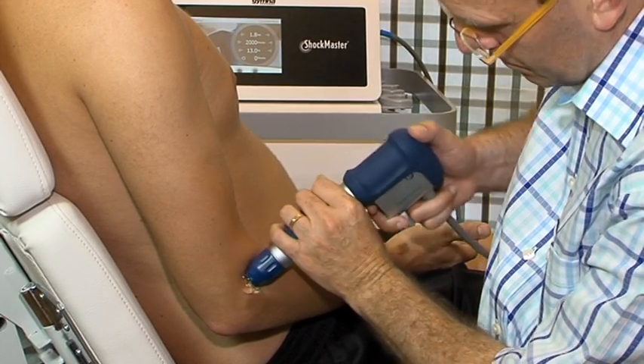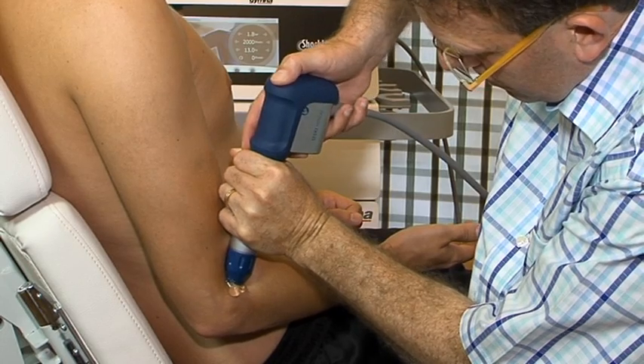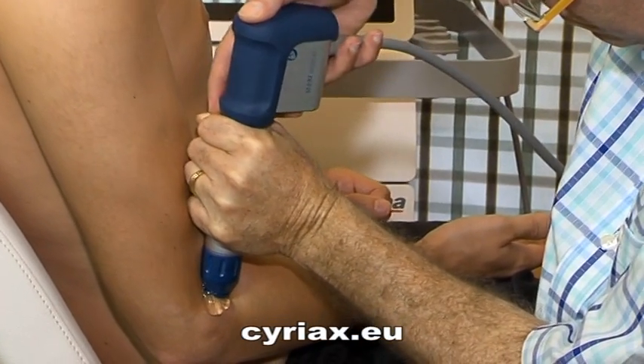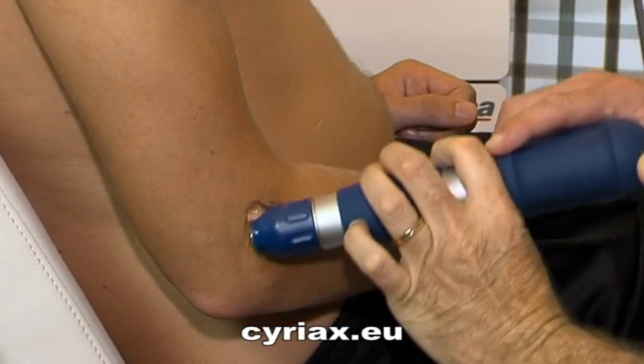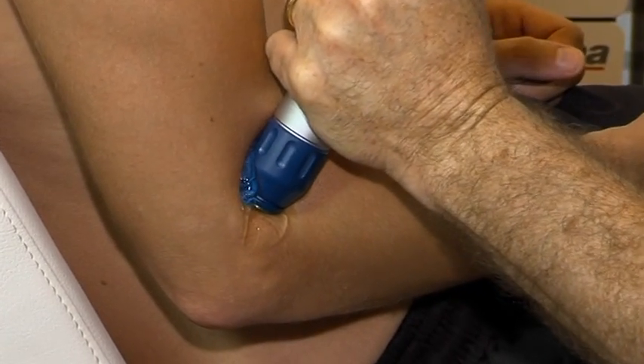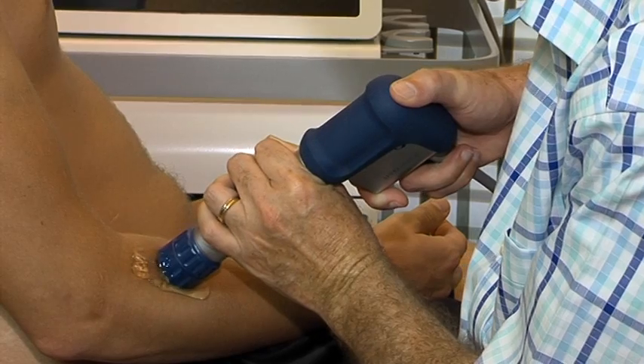Make sure the applicator is in a vertical position. In addition, we can also use the deactor on the muscle belly.